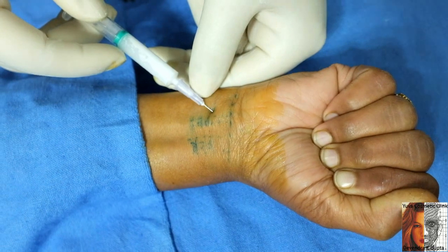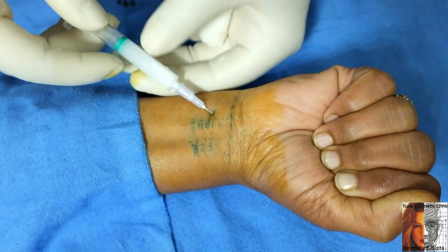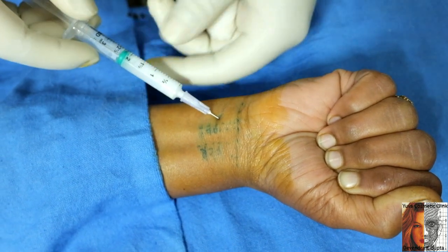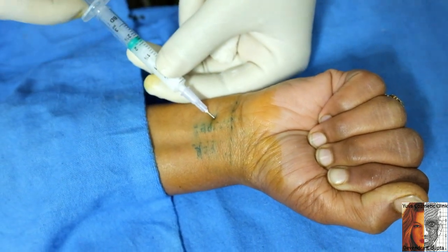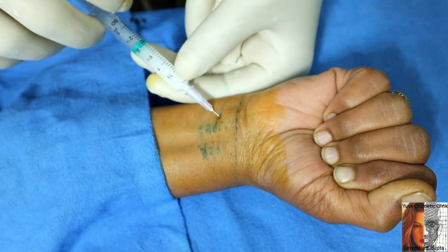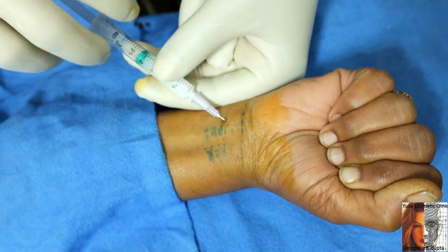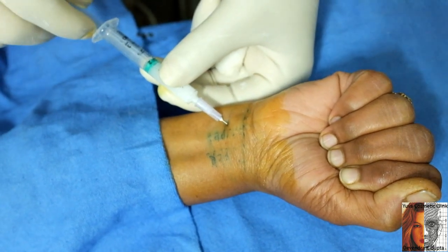Just before injection, aspirate and then inject. If there is any paresthesia, withdraw the needle and reposition it. There is no blood — always aspirate before injection.